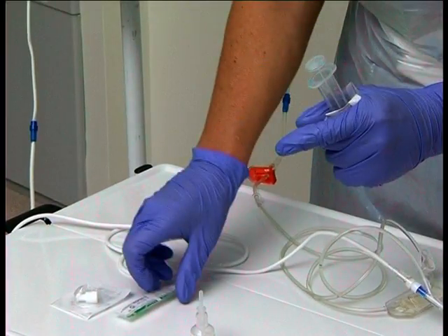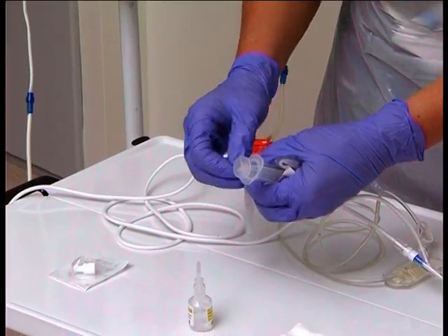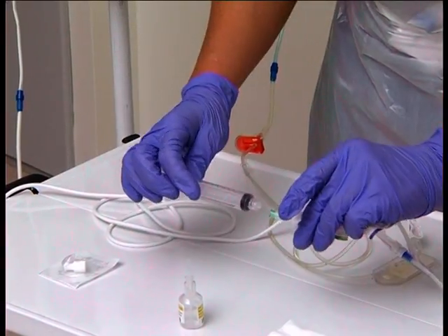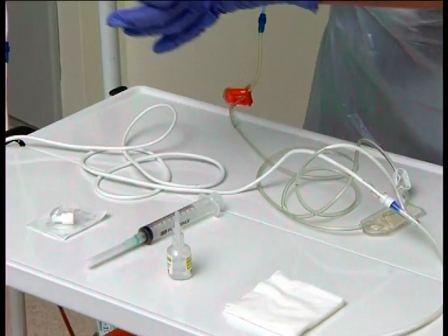Fold the packaging away from the syringe and place it between your thumb and forefinger, keeping the packaging tucked into your hands to prevent any accidental contamination of other equipment. Open the green needle in the same way, taking care not to touch the needle hub, which is an exposed key part. Join the syringe onto the needle as quickly as possible to keep the exposure time for the key parts to a minimum, taking care not to touch the needle hub. Put the syringe and needle on the trolley and throw the packaging away in the rubbish bag.